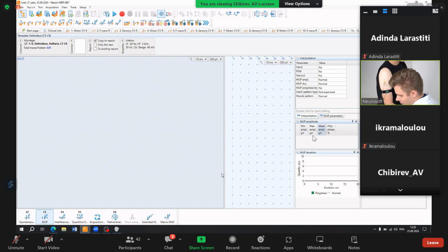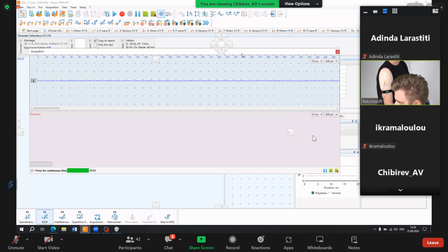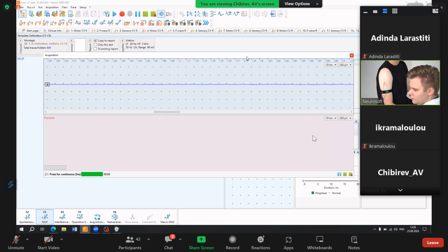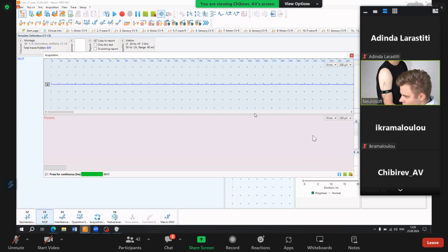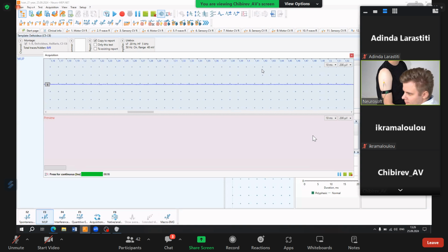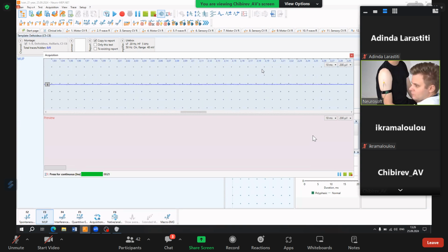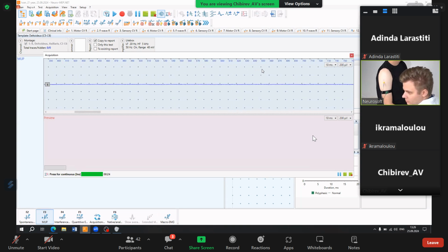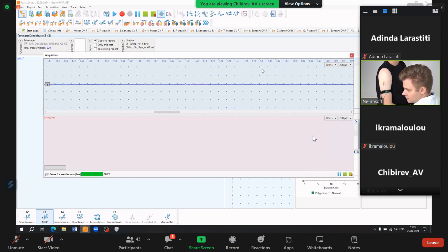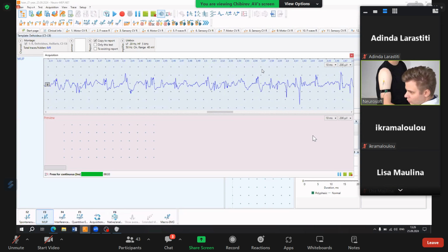Pressing the recording button, we'll see a window with the acquisition. This window is split into 2 different parts. In the upper half, we can see the signal from the needle. Because the muscle is relaxed, we see a pure baseline. But if the patient contracts his muscle, you can see here how the muscle works.